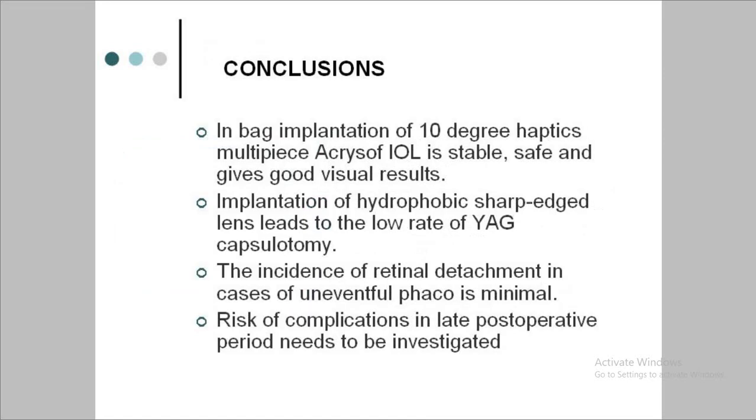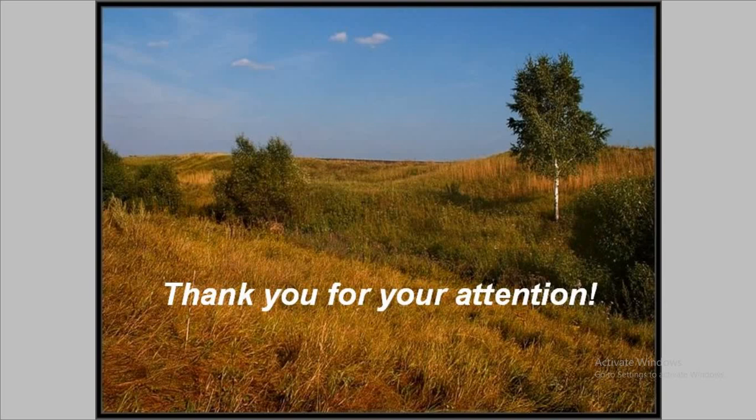And in conclusions, I want to say that in-bag implantation of 10-degree haptics multi-piece AcrySof IOL is stable, safe, and gives good visual results. Implantation of this hydrophobic sharp-edged lens leads to the low rate of YAG laser capsulotomy. The incidence of retinal detachments in cases of uneventful phaco was minimal, and the risk of complications in late postoperative period needs to be investigated.